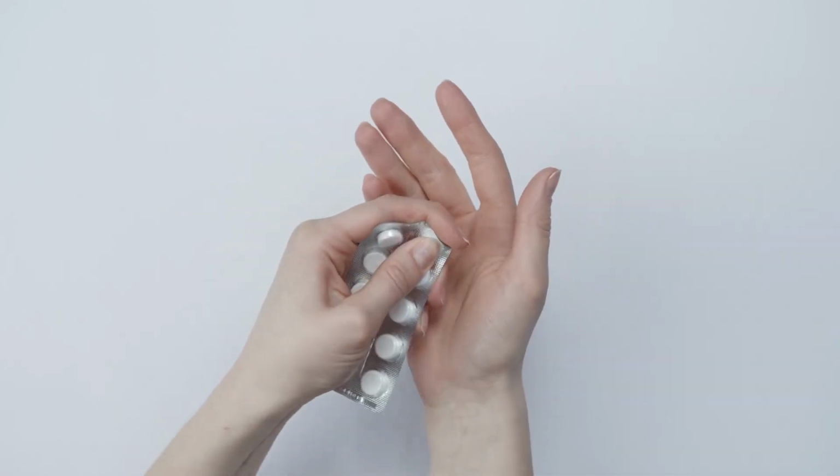Implantable drug delivery system: for that use, the miniature pump is slightly larger than a cardiac pacemaker. It contains the drug reservoir. Concentrated agent at constant pressure will be dispersed in the body. A long thin capillary tube, a tube with high resistance, gives steady and slow infusion to the vein. Drug delivery to specific tissues, like in cancer or chemotherapy, uses this system.